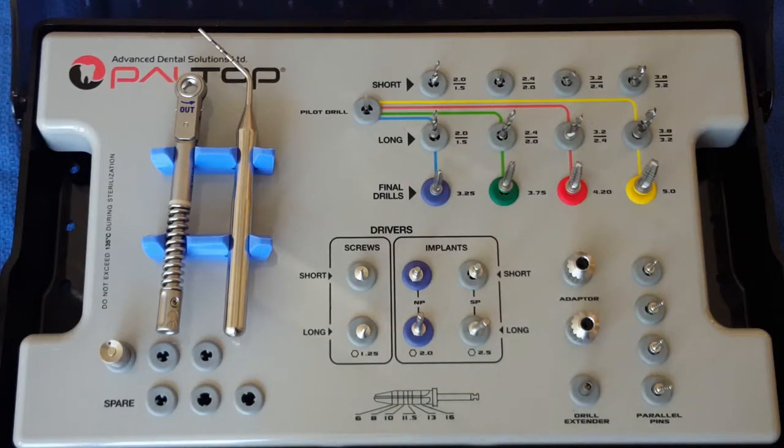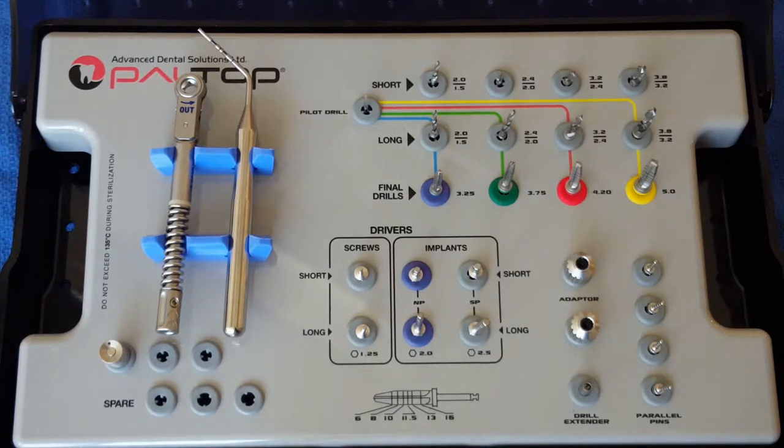The Premier Surgical Kit may be used for the placement of the full line of Paltop implants, including the Paltop Advanced Classic Implant, the Paltop Advanced Plus Implant, the Paltop Dynamic Implant, the Paltop PCA Implant, and the Paltop Diva Implant.